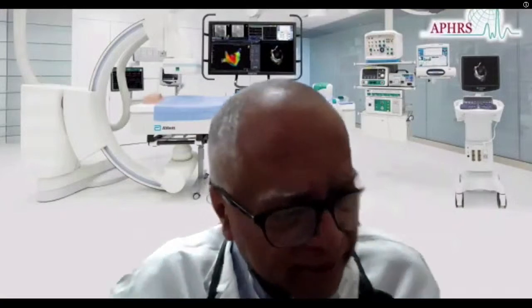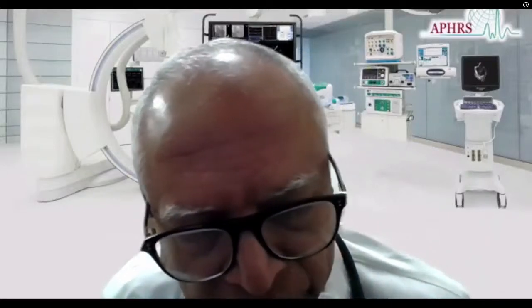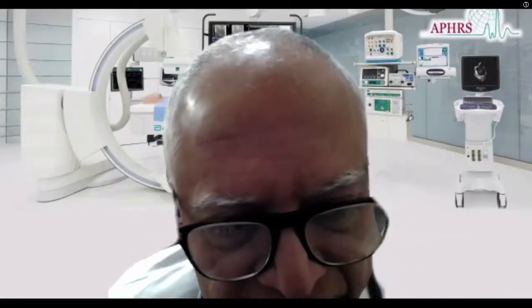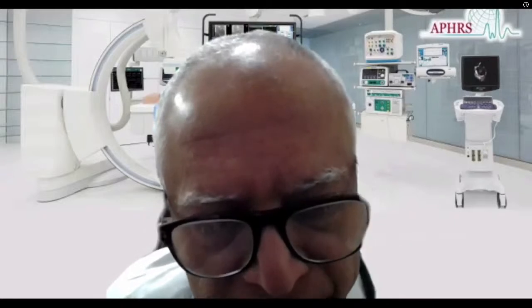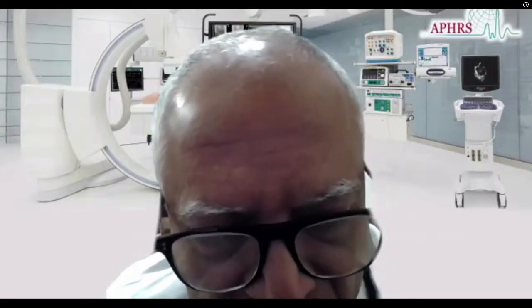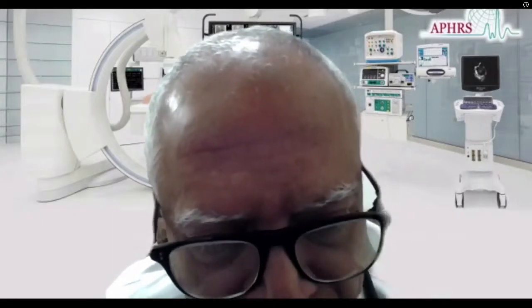Second is, if necessary, ask one of your assistants to torque and hold the catheter constantly at the level of the His, because during ablation, during respiration, the His catheter should not move. And third, make sure that the VA ratio, that the A is quite small compared to the V. And in these patients, make sure that the ratio remains constant over a couple of beats. If there is a constant change in the amplitude, A becoming periodically larger, that indicates it's an unstable location.